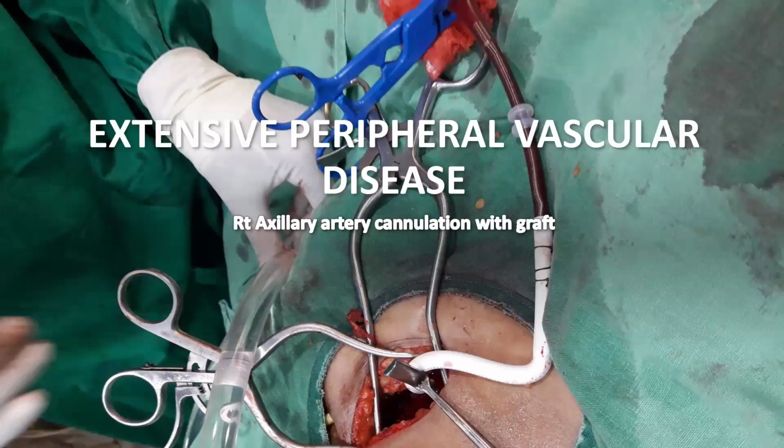The benefit of this is that we have an open chest. We can put in an LV vent, which is always connected to the venous cannula. Why the venous cannula? Because the vein is draining blood at a negative pressure. This is why the LV vent is connected there and drains the blood.